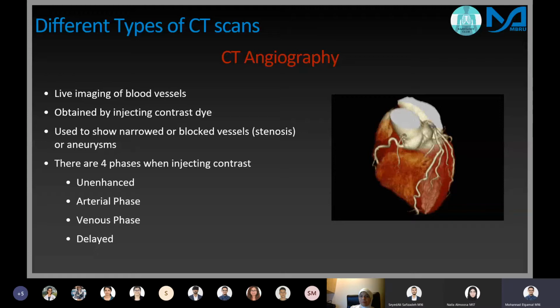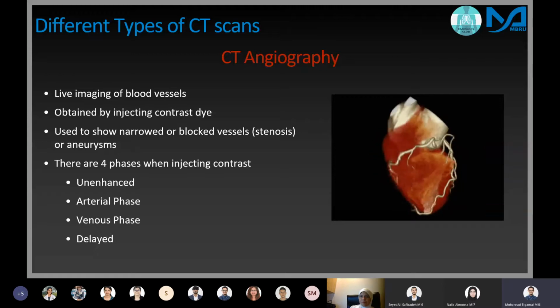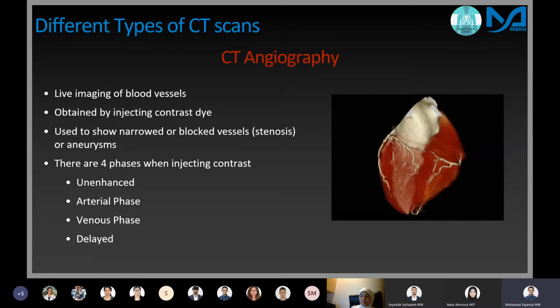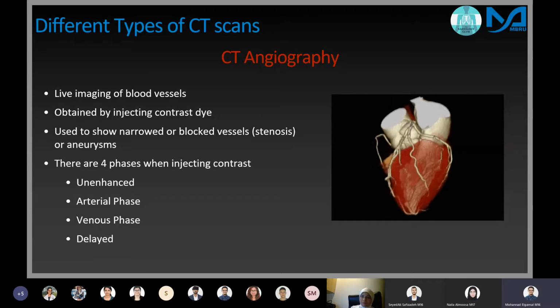And this is used in situations where they suspect there's any stenosis or narrowing of blood vessels or any aneurysms in the brain or any abnormal movement of the blood, or even sometimes you can tell if someone's bleeding by seeing it leak and things like that.